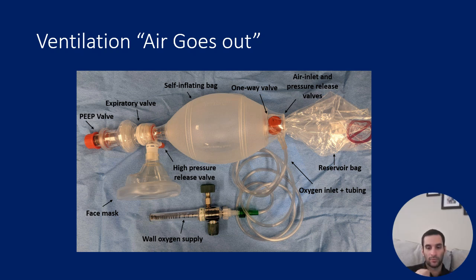So let's look at that a little bit further. I mentioned ventilating upright. I mentioned certain positioning advantages. Let's look at the bag valve mask for a second and then come back to positioning.